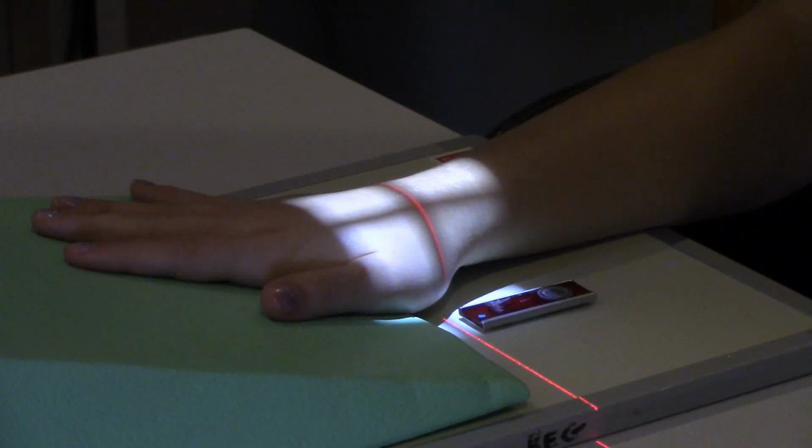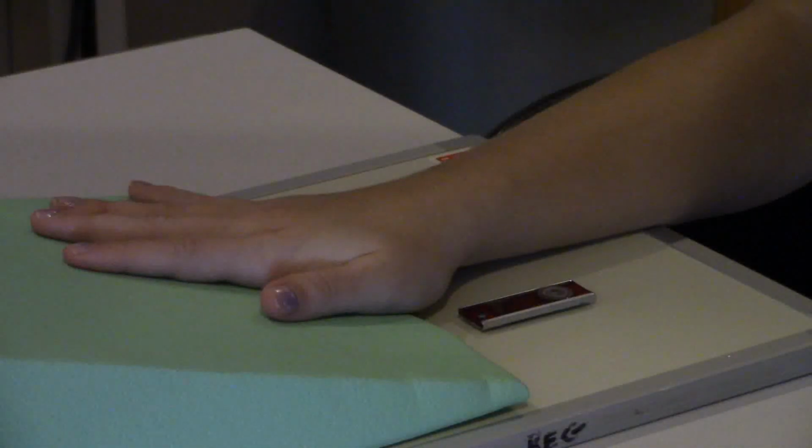You want your marker to be, now in this it's easy because we have light outside the patient's body, so we can just put our marker there, no problem. But when you're doing something like an abdomen, your patient's taking up the whole screen, right? So then your marker is going to be in anatomy. So we just want to make sure that even though it might be overlaying, it won't mess up the doctor's diagnosis.